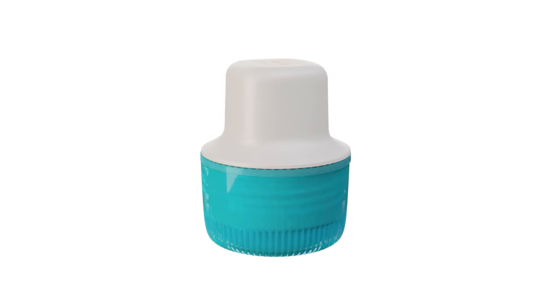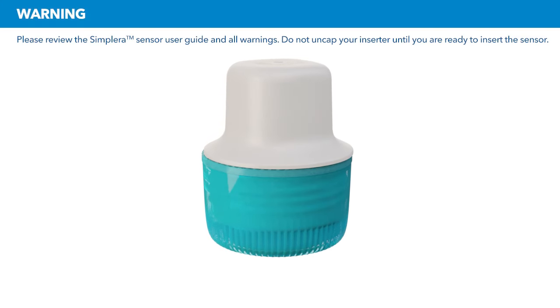In this video, we are going to show you how to prepare to insert the Simplera sensor. Please review the Simplera Sensor User Guide and all warnings. Do not uncap your inserter until you are ready to insert the sensor.